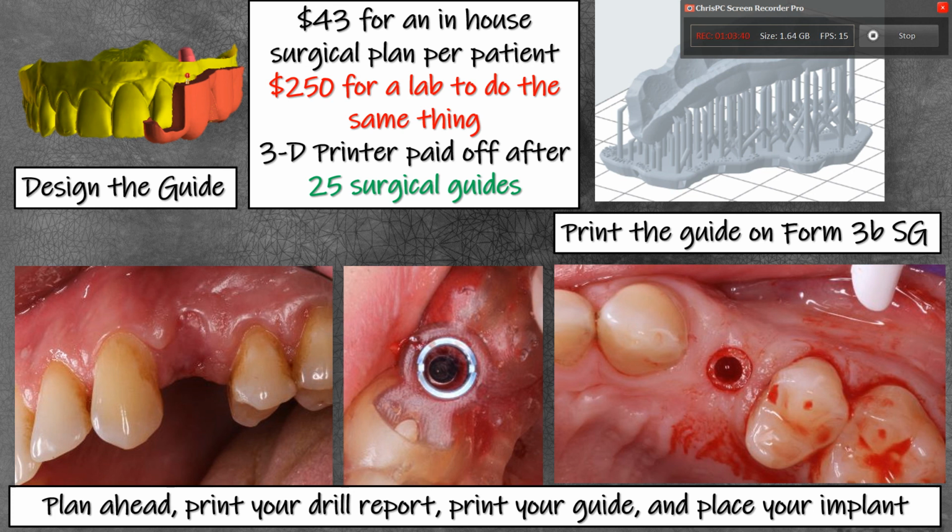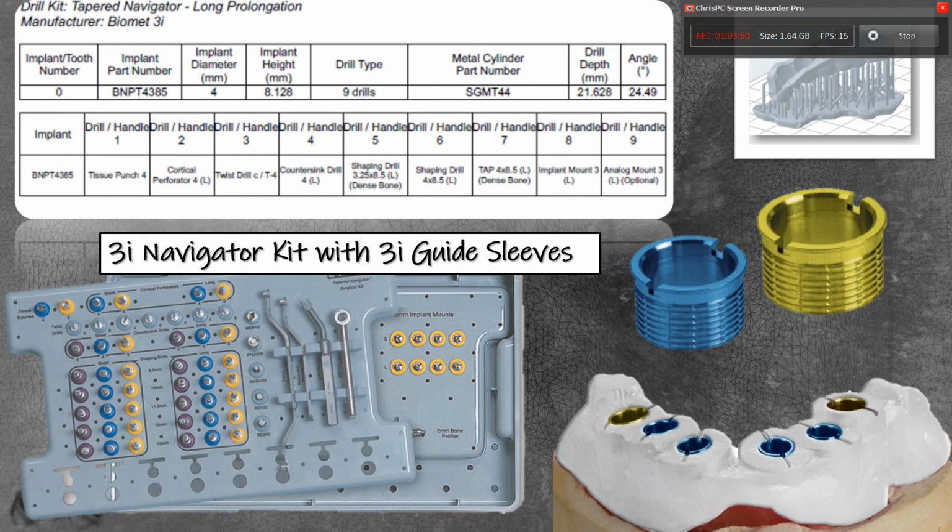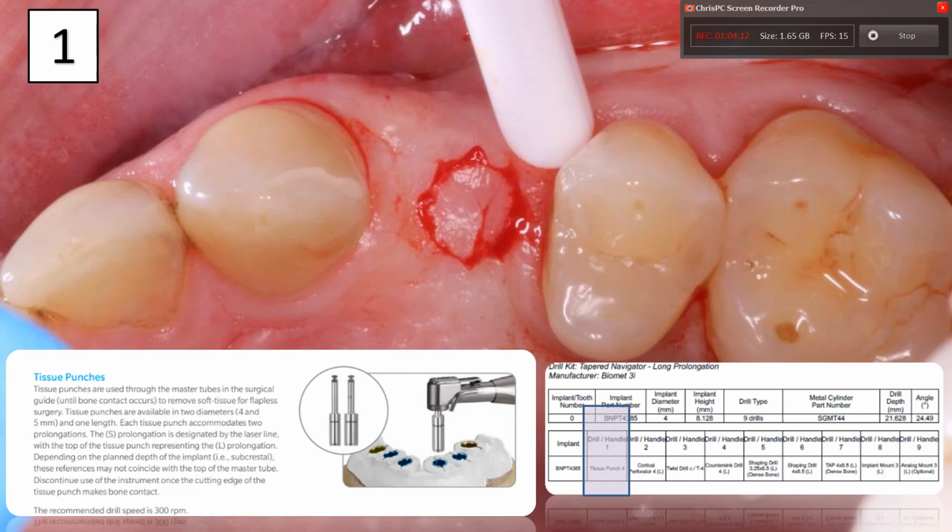So you can see how this is really helping out your chairside scanning efficiency beyond just the single tooth or multi-unit crown. If you're not sure what a guide sleeve is, different implant manufacturers have these guide sleeves with little keys in them, so that way we know exactly where the implant will stop, so we know where the hex will end. So we can actually, if we wanted to, plan the crown ahead of time, and once the implant is placed, we can place the crown on there assuming we have the right torque value.